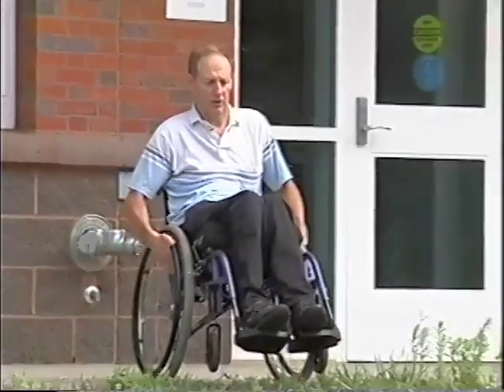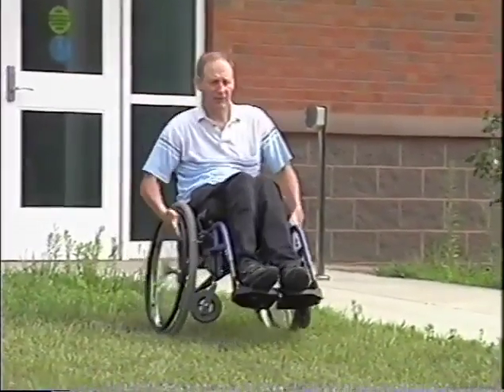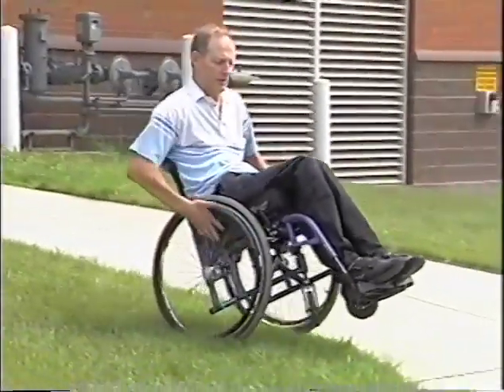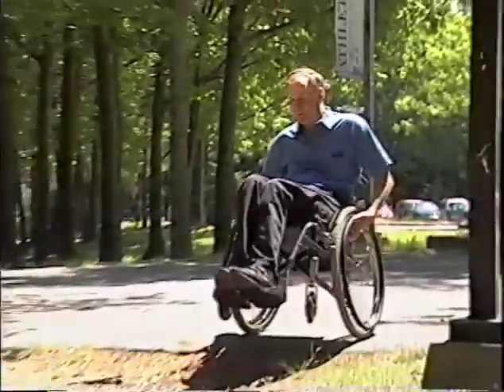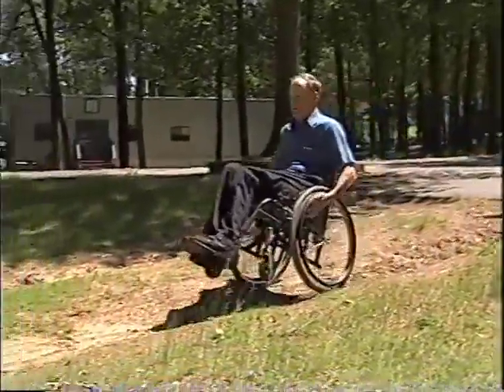Once you've mastered going down the smooth ramp in a wheelie, you might want to practice going across lawns and little downhill places like that where you'll have to push to keep yourself going. But it's still a very good skill. And as you get it down, you can move to steeper and steeper terrain, and eventually you'll be able to handle just about anything with it. Sometimes in life the world gets a little bit rougher. For this, you can sometimes just pull a wheelie and go down, keeping your wheelie, and you're pretty safe.